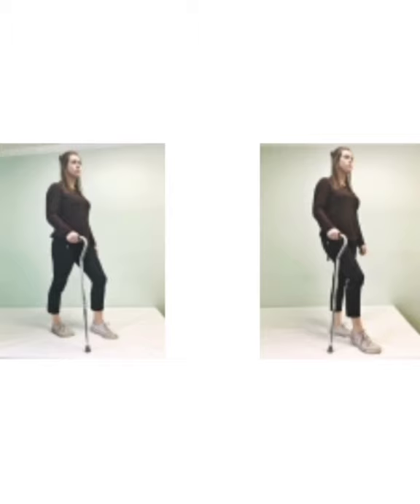Secondly, for proper use during gait: if you have an injured or weaker leg, you would use the cane in the opposite hand. But for balance purposes, you may choose whichever side you feel the most comfortable and secure. Advance the cane and the opposite leg at the same time, then step with the other leg.